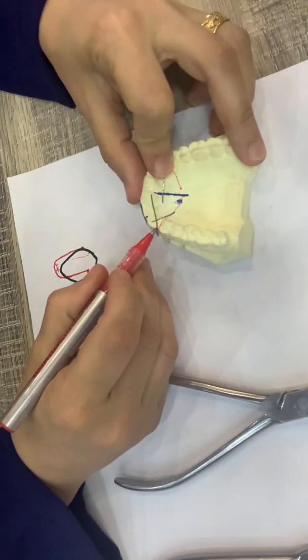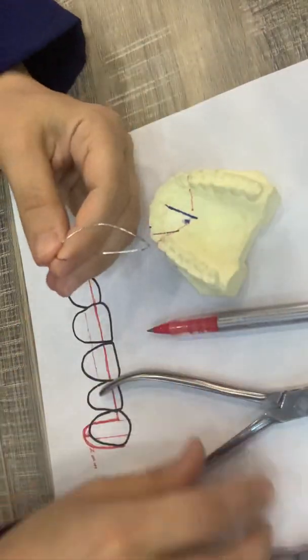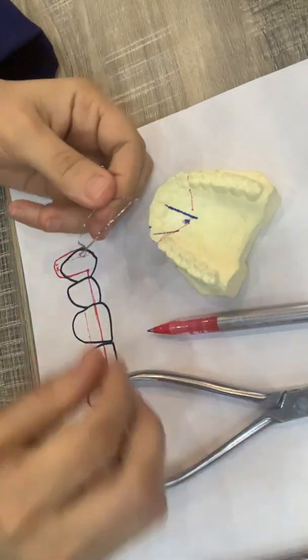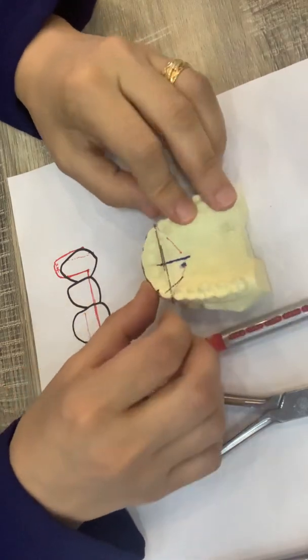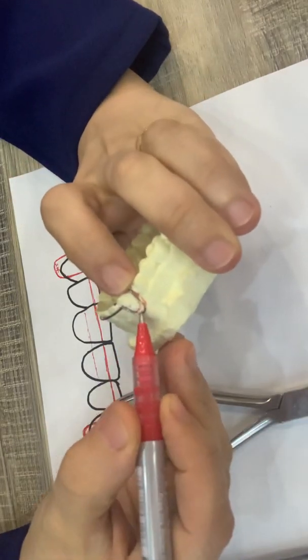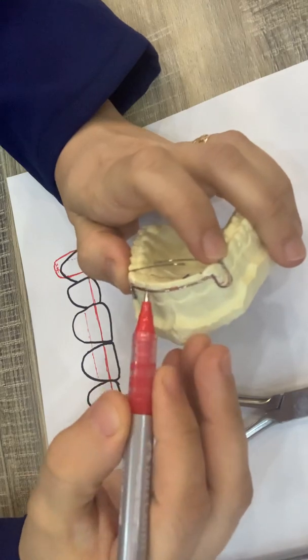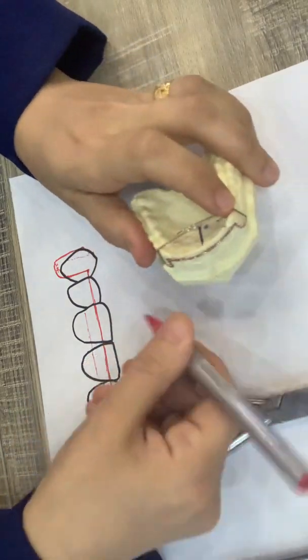And I make a mark for the occlusal part of the other side, this way. Okay, 2 millimeter from the gingival margin, and the position of the labial bow is at the junction between incisal and middle third, and in this position, okay, 2 millimeter.